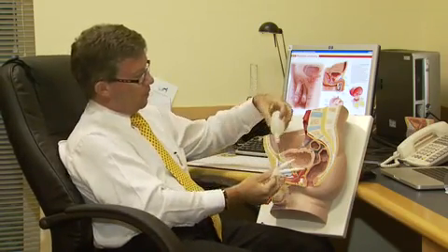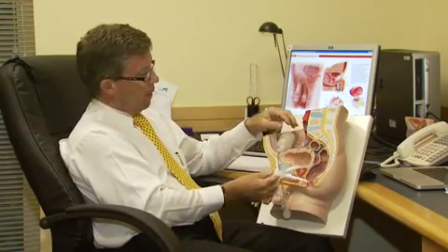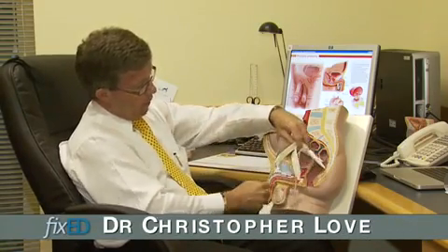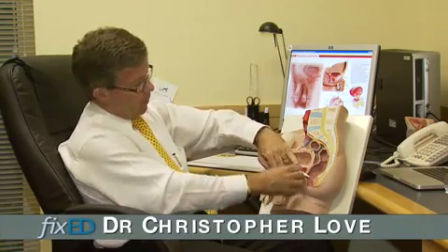The way this works is the reservoir is inside the body near the bladder, the cylinders are inserted inside the actual penis itself, and the pump sits in the scrotum between the testicles.